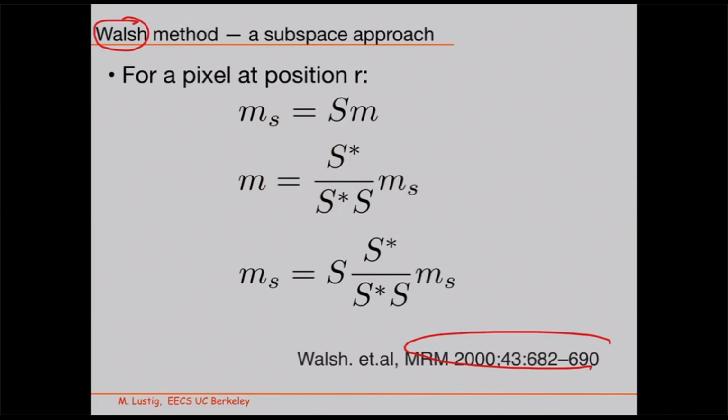Okay, but if I get a single image and I multiply it by S, that should also be true, right? But that is also MS, right? So MS, the individual coil images, is really taking the individual coils, combining them, and then multiplying back by the maps.